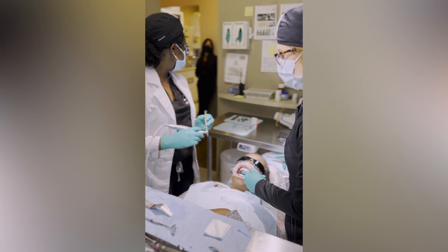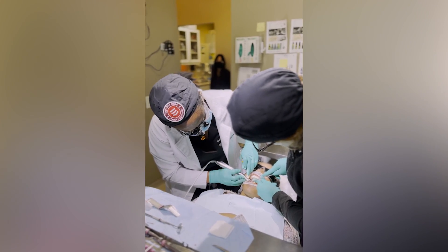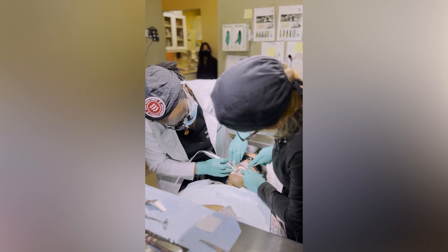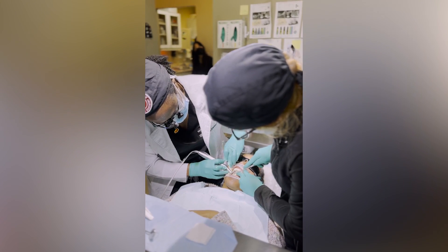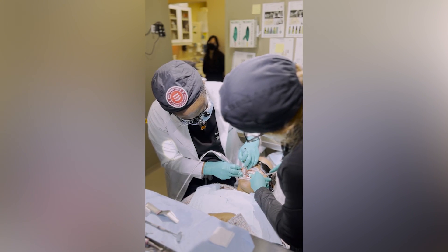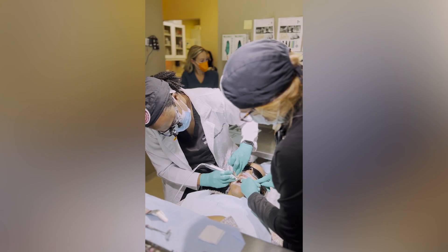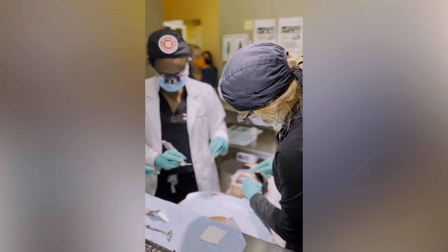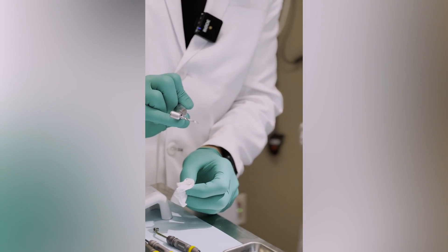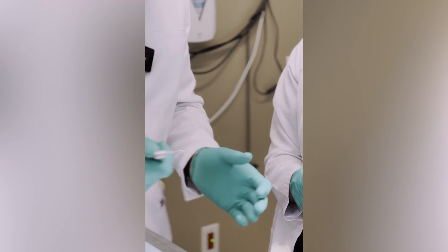So we've sectioned the bridge, we've extracted the tooth, we have a good amount of radicular bone, and what we're doing is creating the osteotomy. Just give it some apical pressure — push a little harder. You've got a couple millimeters there. Now stop for a second — have your assistant just grab a two-by and clean that out, and then you can go back in and make sure you go all the way. Sometimes it gets hard. Pull it out all the way, clean the flutes, and then go in the rest of the way.